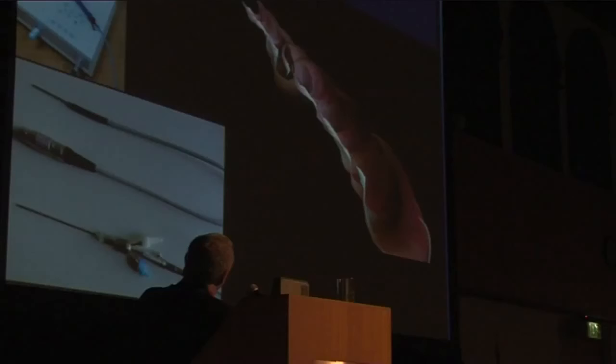And in the future developments, in the future, we'll have 3D image. As you can see here, this is the first 3D image of a parotid duct. So it will give us a better option to view and to navigate inside the ductal system, and digital endoscopy for a better picture.